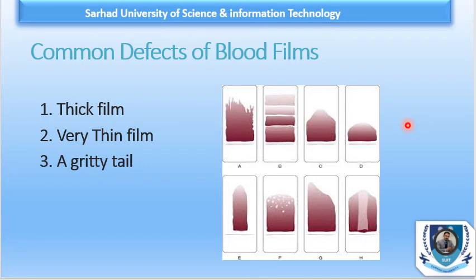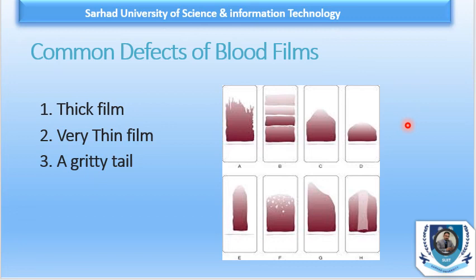Common defects and their causes: a thick film results if the blood drop is too large, spreading is done too quickly, or the angle of the spreader is too high. A very thin film results if the blood drop is too small, spreading has been too slow, or the angle of the spreader was too low. A gritty tail results if spreading was too slow, there was a delay in spreading, only part of the blood drop was utilized, or the spreader was not appropriate. In addition, some anticoagulants other than EDTA and high TLC also give rise to a gritty tail.